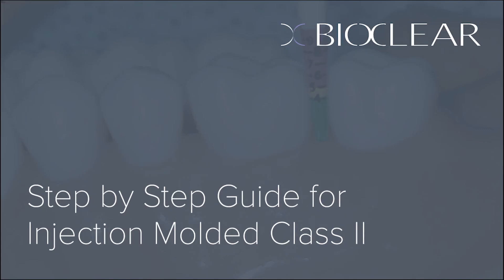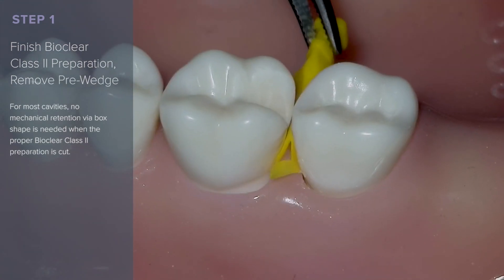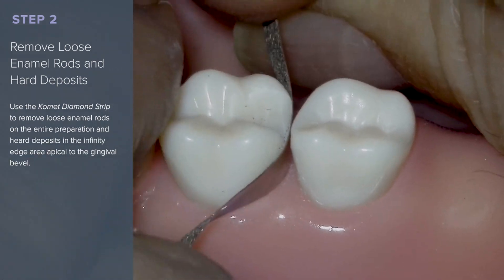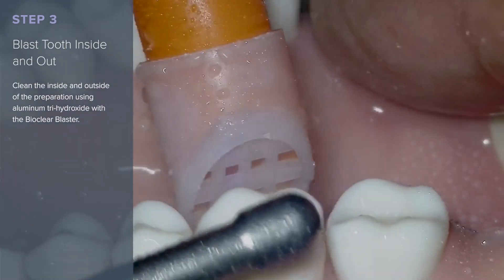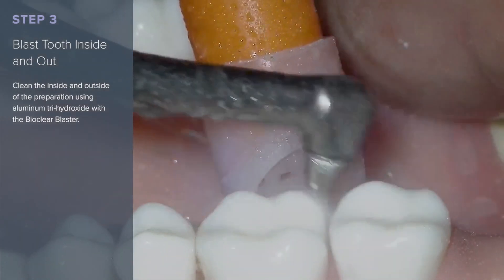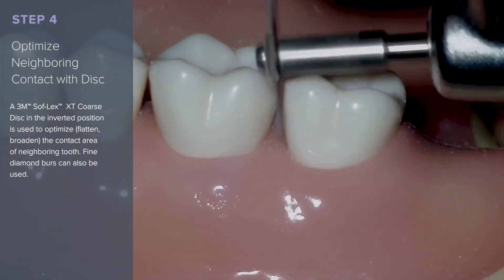Welcome to the Bioclear step-by-step guide for the Injection Molded Class 2. Finish the Class 2 preparation and remove the pre-wedge. Remove loose enamel rods and hard deposits like calculus with the Comet diamond strip. Blast both the inside and the outside of the tooth using the aluminum trihydroxide in the Bioclear blaster. Optimize the neighboring contact with the disc.